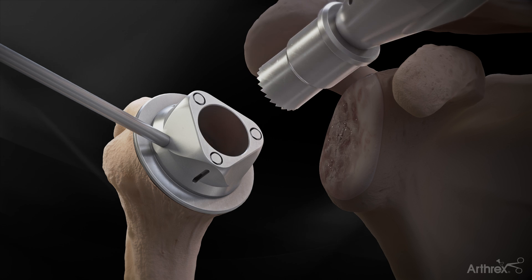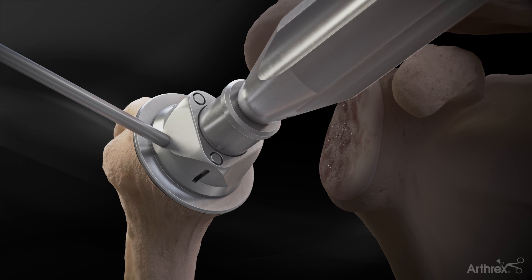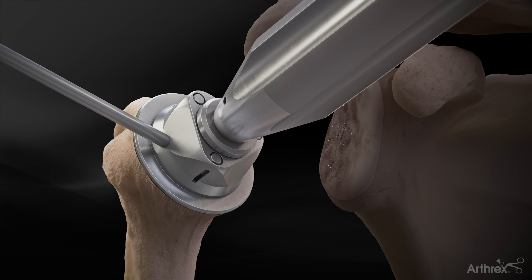To prepare the humerus for the cage screw, the coring reamer is advanced until the depth stop touches the template.